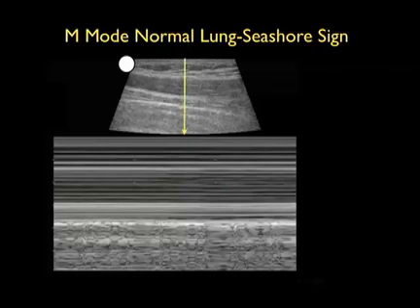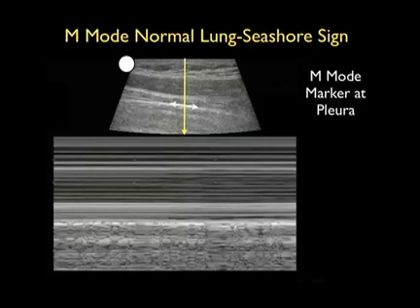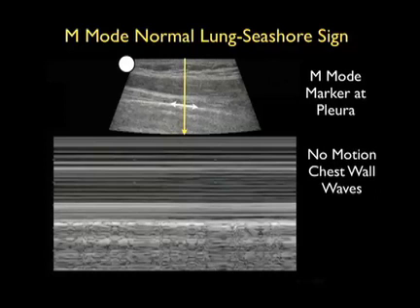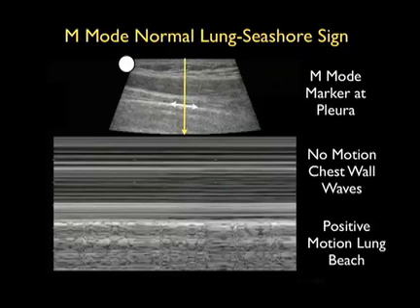A way to document that the lung is up to print out for the chart is to put M-mode. Generally what we do is locate it so the M-mode cursor is down right at the pleura. And what we see is the classic seashore sign or waves on the beach. If we look anteriorly, we'll see the classic waves or no motion of the chest wall, and below that, deep to the pleura, we'll see the positive motion of the lung making up the beach. So waves on the beach or the seashore sign in M-mode documents that the lung is up and that there's no pneumothorax.